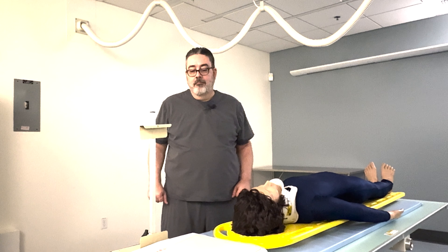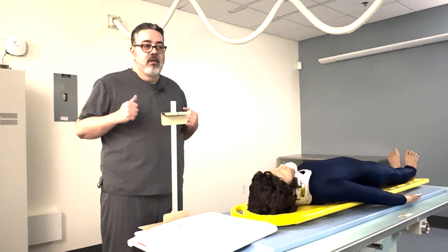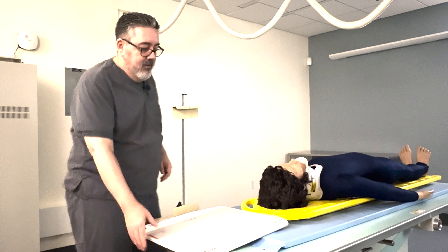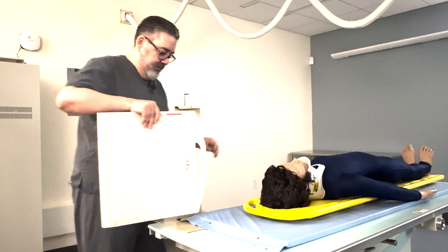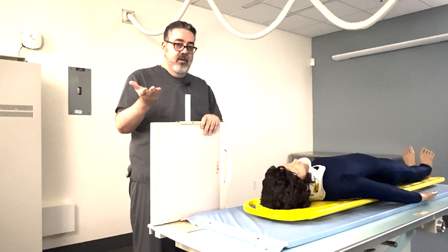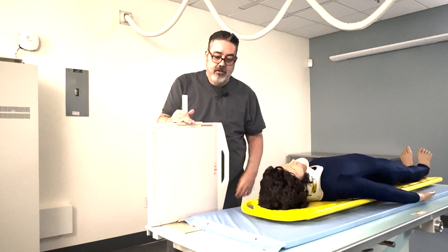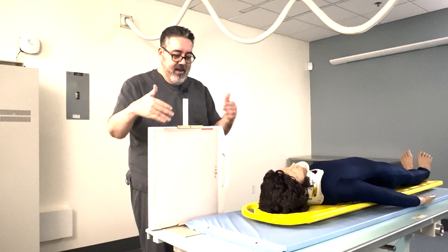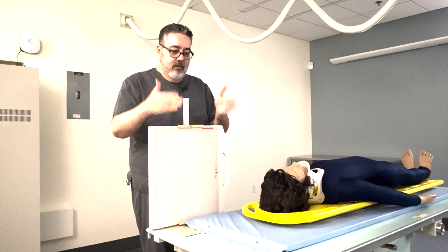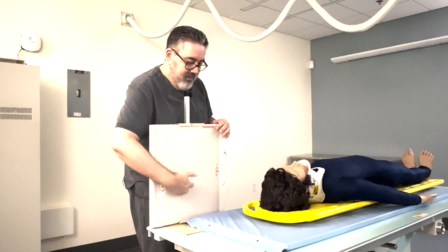A few points here to make. If you have a 10 by 12 cassette CR — and it's going to apply the same as our 14 by 17 — if you're using a grid cap, make sure you're turning it crosswise as the patient is oriented. This looks lengthwise to you and me, but as the patient is oriented, it needs to be longer from anterior to posterior. Considering that we may not be centering right at the middle of the grid, doing it crosswise with the grid lines going vertically here is going to prevent grid cutoff if it ends up being a little bit lower.